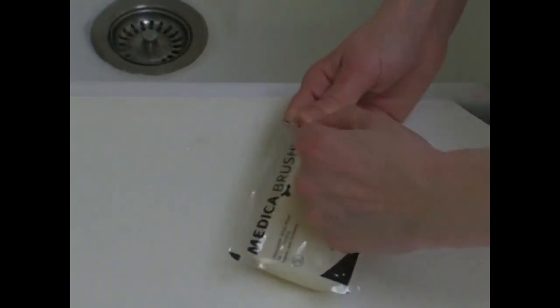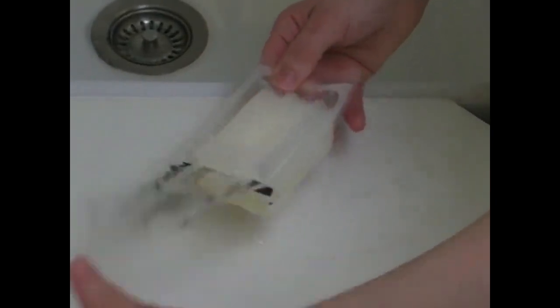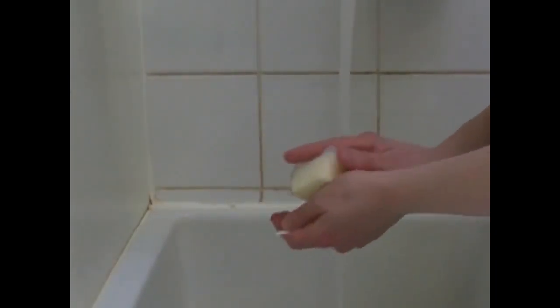A chlorhexidine soap is used to disinfect the hands. Alternatively, an iodine-based soap such as Betadine can be used. The hands, wrists and forearms are washed for two minutes. The assistant will ensure that all the surfaces of the hands are thoroughly washed. This includes the palms of her hands, the areas between the fingers and thumbs, and the fingernails, which must be short.